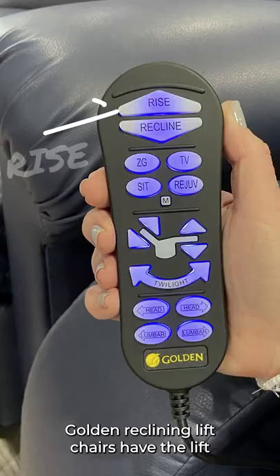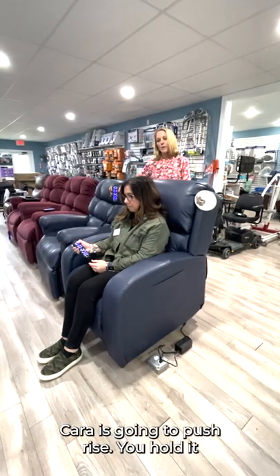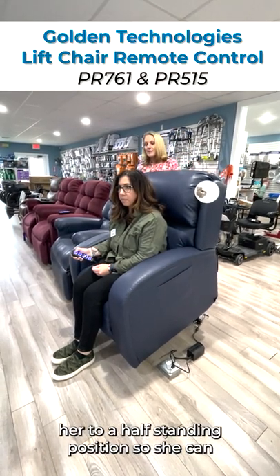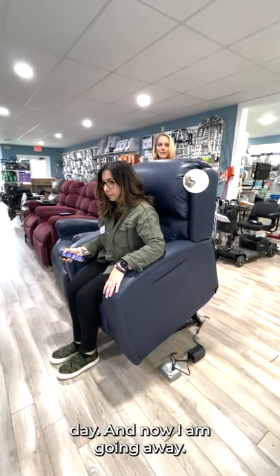Of course, all these Golden Reclining Lift Chairs have the lift functionality. On this remote it says rise. Kara's going to push rise — you hold it down — and slowly, gently, it's going to bring her to a half-standing position so she can safely exit the chair and move about her day.